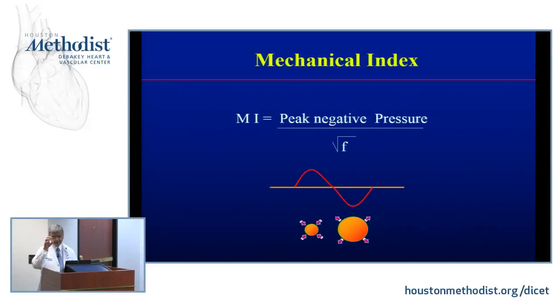Every time they're exposed to this ultrasound wave, if it is on the positive pressure portion, what's going to happen is they're going to shrink down. So they differentiate a high from a low pressure. I mean, the frequency is very high. But I think this is just to illustrate the concept that this mechanical index, or MI, which is visible on your screen, is very important in your settings.